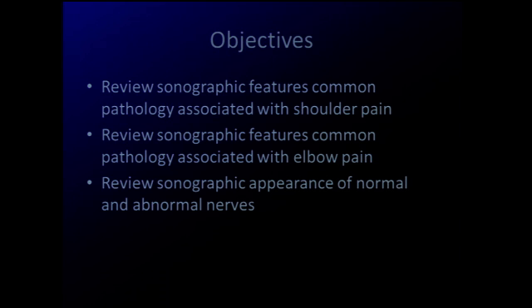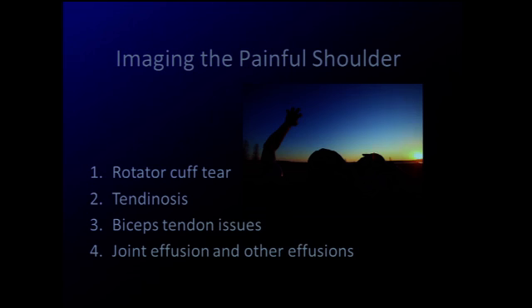I have no disclosures, and my objectives are to discuss common pathology associated with shoulder and elbow pain, as well as review the sonographic appearance of normal and abnormal nerves.